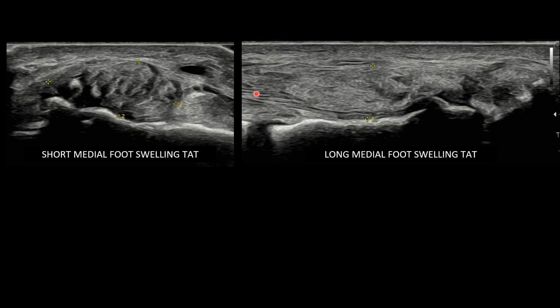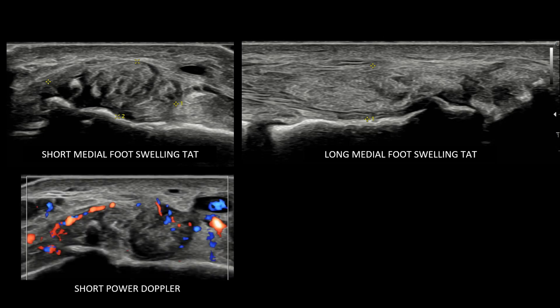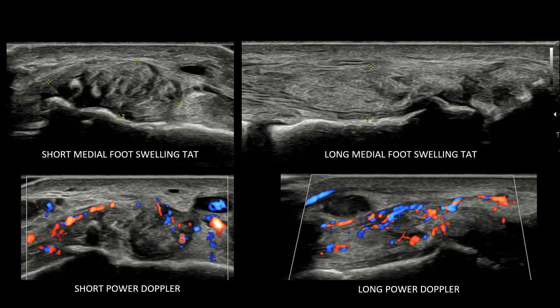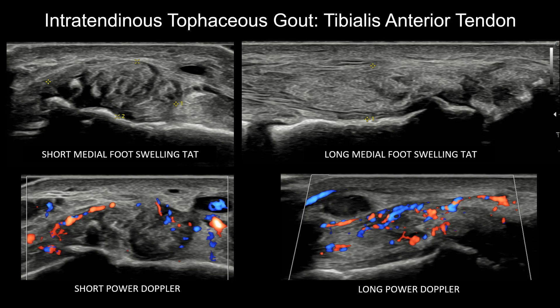Speaking of intratendinous gout, this patient presented with foot swelling at the medial foot, also with a history of gout. In short axis, there's an amorphous echogenic structure in the region of the tibialis anterior tendon. In long axis, you can see the tendon fibers, and within the tendon there is an amorphous echogenic mass-like structure containing punctate echogenic foci. As the tendon approaches its insertion on the medial cuneiform and first metatarsal, power Doppler imaging shows marked hyperemia and increased vascularity about the tendon, typical for inflammation. This is intratendinous tophaceous gout involving the tibialis anterior tendon.